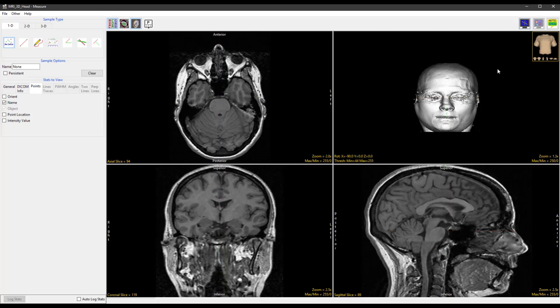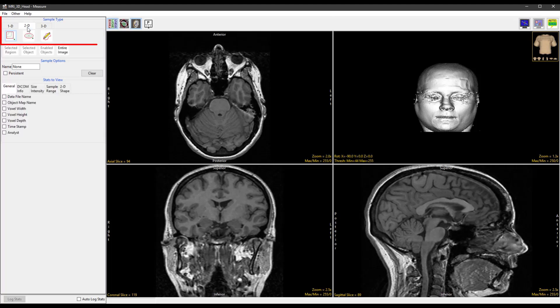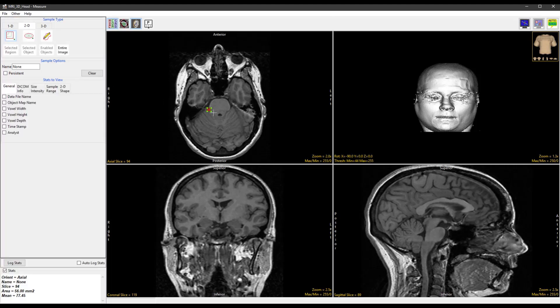Select the 2D sample type and choose Sample 2D Rectangles. Define a rectangle on the current axial slice by clicking and dragging the cursor.